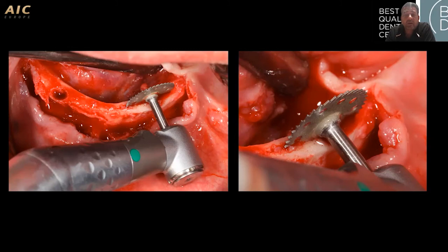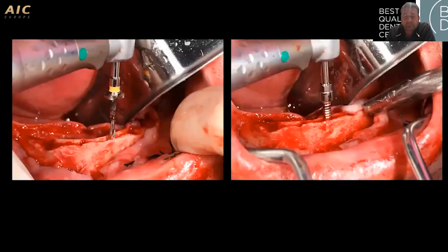Okay, we have done the splitting, and then we started with the set drill, pushing the bone apart to increase the cortical bone split. We are only going to put 2 implants in place, but we need to do at least 4 holes, 4 sides, where each side is going to help us get more splitting, because the dynamic in this kind of bone, D1, D2, is a little bit harder.